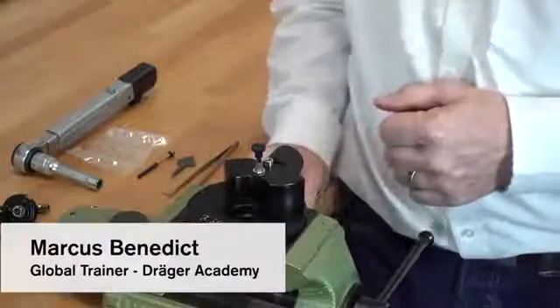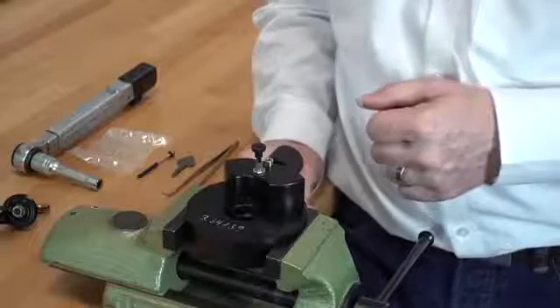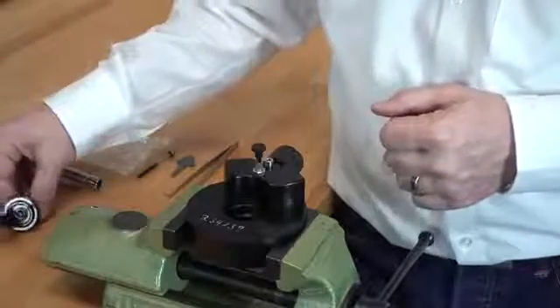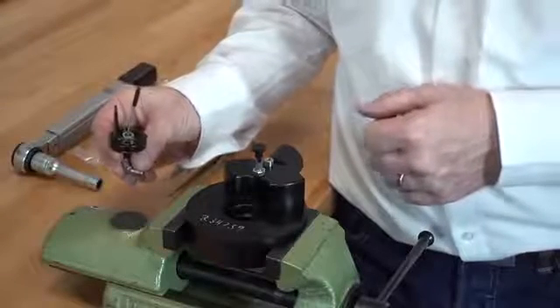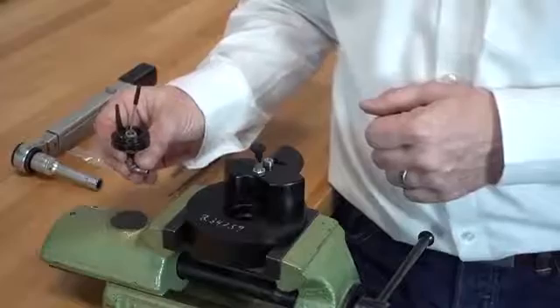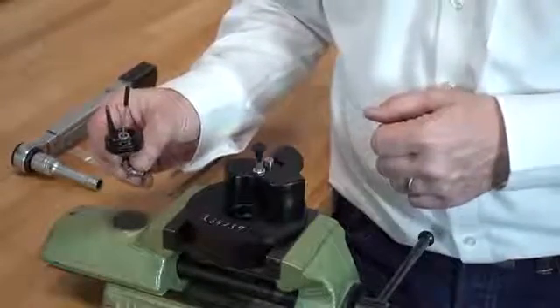When testing the opening pressure of the minimum valve, we found an early opening of the minimum valve. When taking out the minimum valve from the breathing bag, we noticed that the tilt valve lever was bent out of shape. We will now change the tilt valve lever.